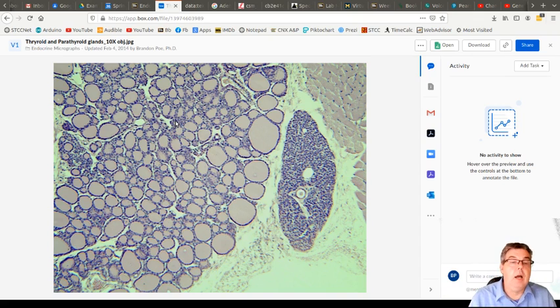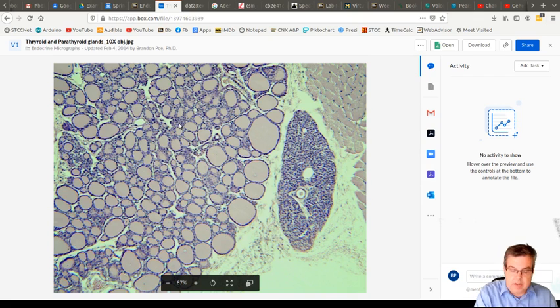here and there. The reason why this might not be what I'm talking about is I might be looking at the edge of a follicle just being shaved off. Not as likely, but just to be completely truthful here, I can't be sure that those are technically parafollicular cells, but for the information we have, we'll call those parafollicular cells. Or these right here, parafollicular.